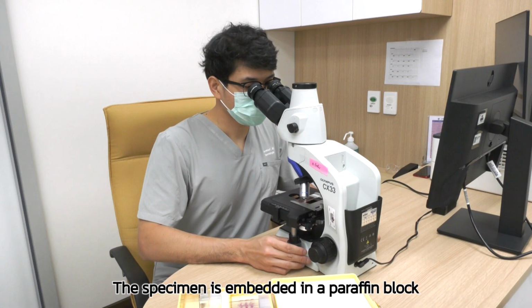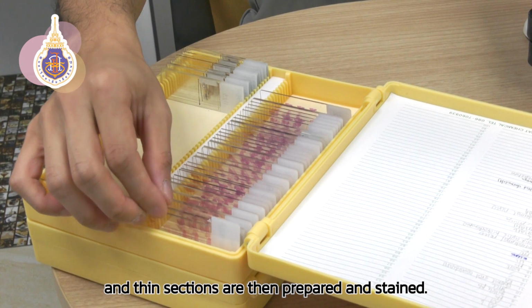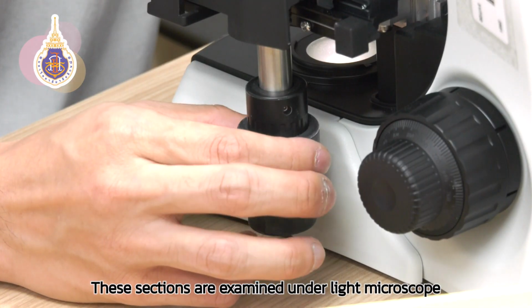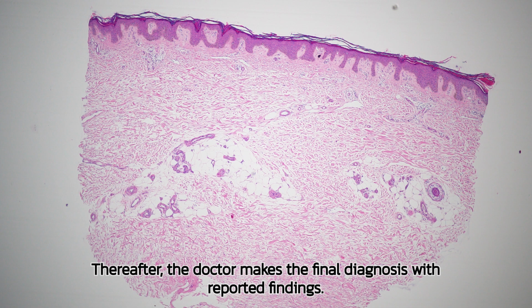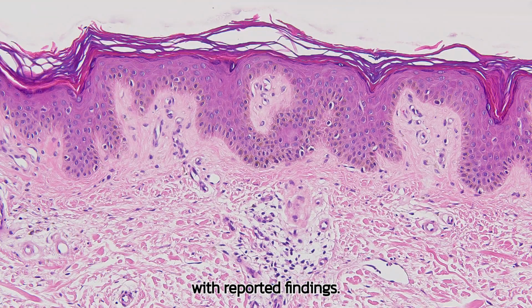The specimen is embedded in a paraffin block and thin sections are then prepared and stained. These sections are examined under a light microscope for identifying pathological findings. Thereafter, the doctor makes the final diagnosis with reported findings.